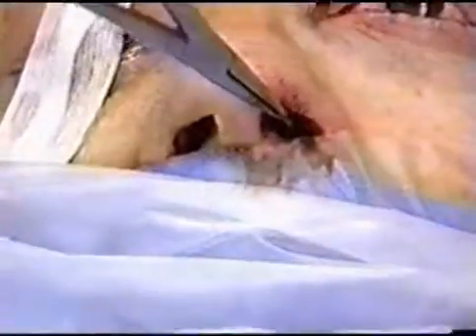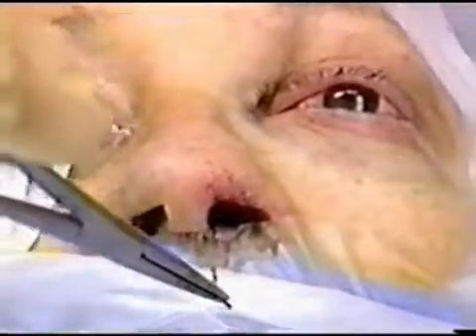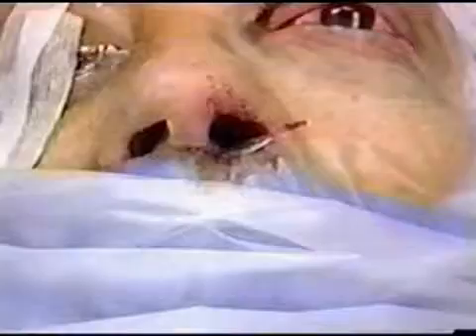The sheath is then grasped with a straight mosquito hemostat intranasally and pulled down the nose and out the nares. The mosquito hemostat crimps the end of the sheath, and the very distal end is therefore cut off.